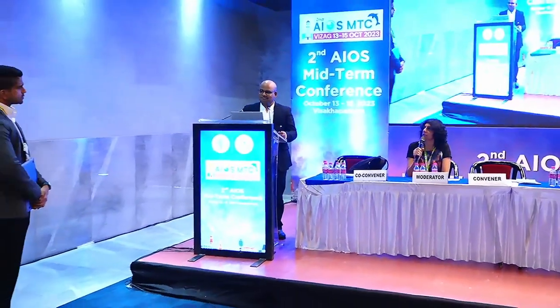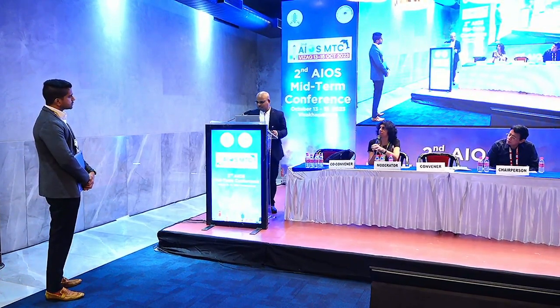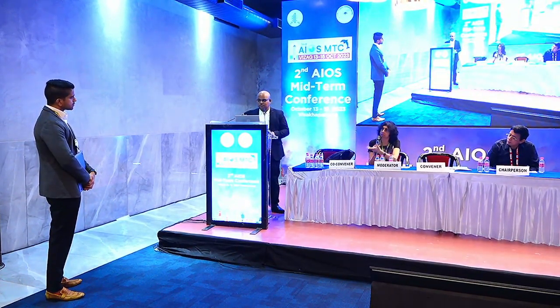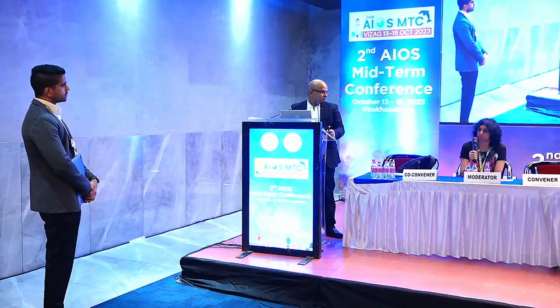Okay. But I think when you're doing the aspiration, if your aspiration port is very close to the central flow and you keep it there for some time, then that ideally would clear out all the HPMC that's in the AC, and Diamox postoperatively would help. I don't think that, at least for the several years that we've been doing this, in the beginning we would have this fear that the pressure would be elevated, but then over time you realize that with a certain amount of time spent in the AC, like you said, a minute or whatever it is, the chance of having a rise in intraocular pressure is much, much less. Yeah.